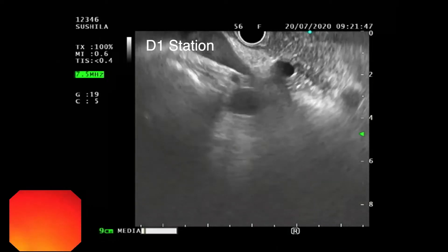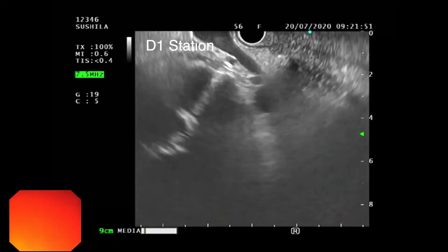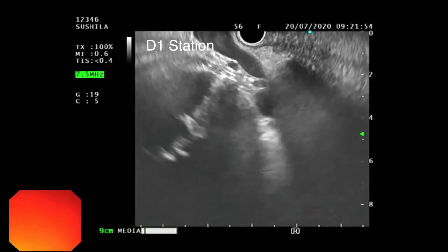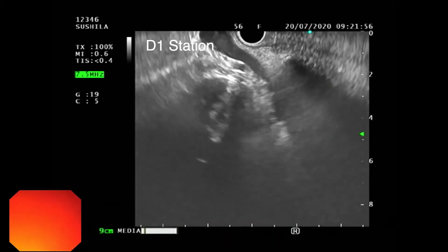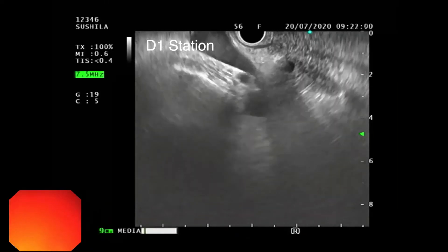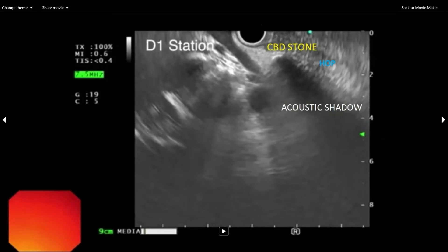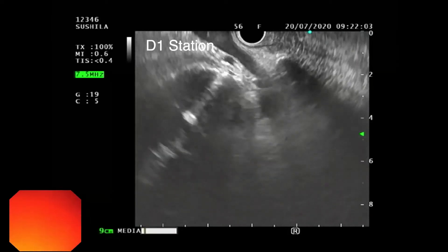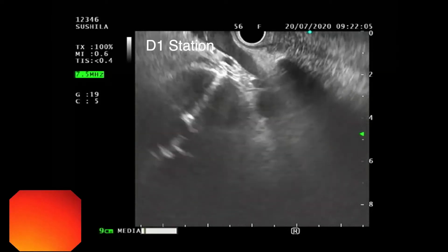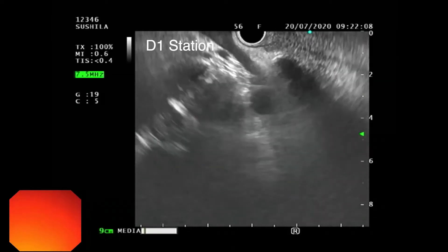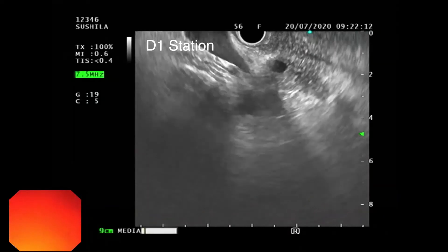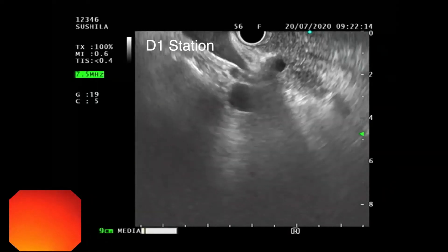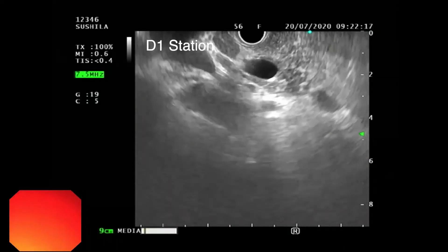We can notice a CBD stone causing a posterior acoustic shadow. The CBD is prominent and dilated because of the obstruction caused by the CBD stone.